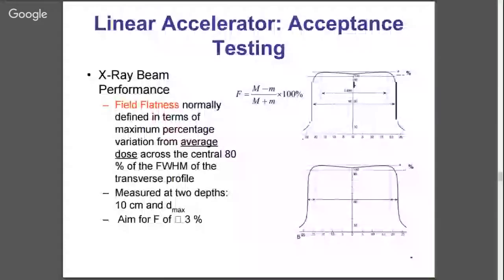Another important aspect is the field flatness, although of course in recent years there's been the development of flattening filter-free linear accelerators, so we can now deliver treatments without a flattening filter. But even these machines typically will also still have the flattening filters in them, so we still need to measure this flatness that we get when we use the flattening filter.